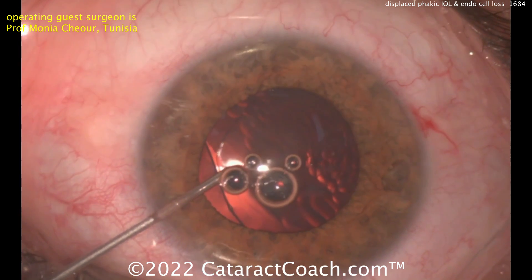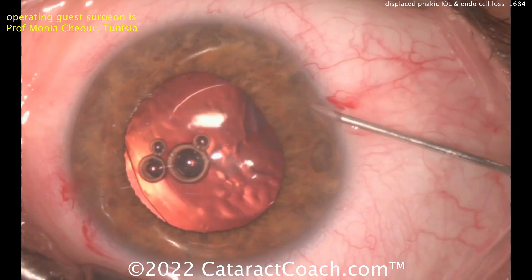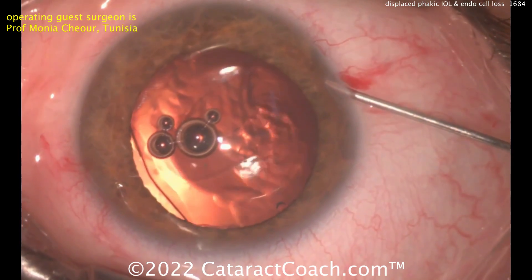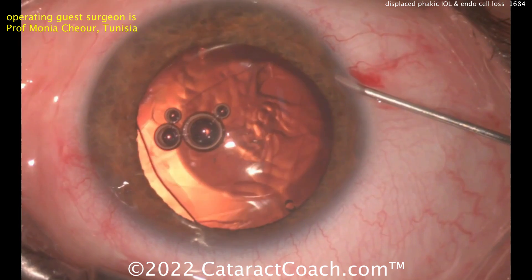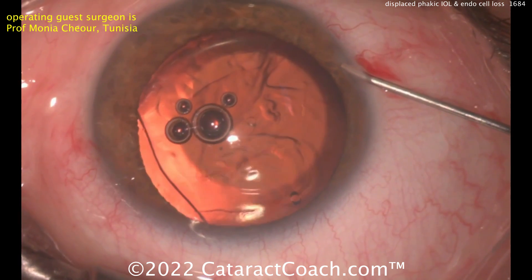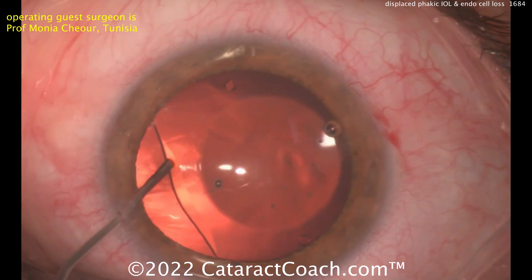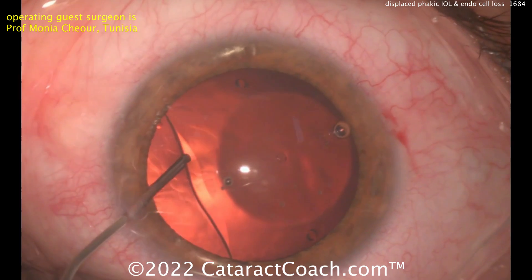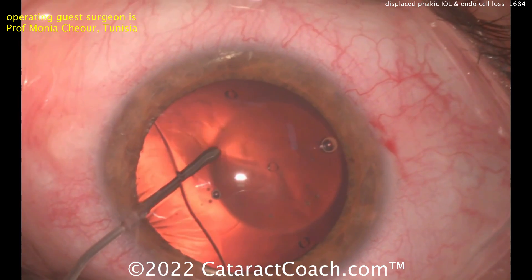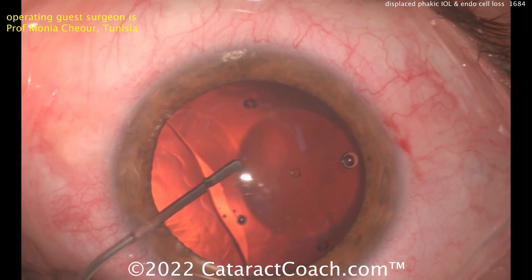So what do you do in this patient? A lot depends on the patient's age. This patient is 22 years old — it's really not ideal to make the patient pseudophakic. But you can see that, for whatever reason, maybe there's a sizing issue or a placement issue, this lens is just not appropriately sitting in this eye.